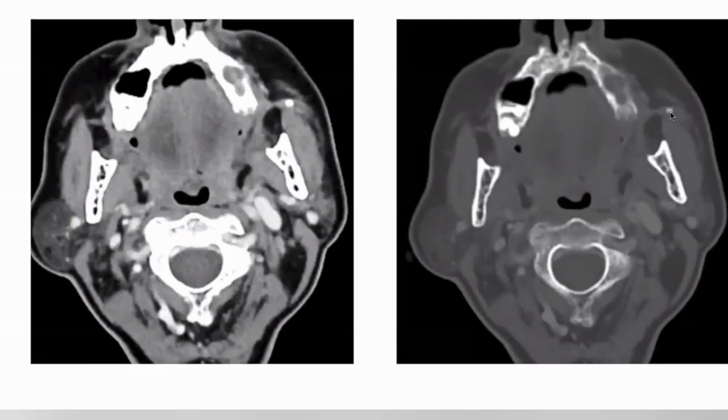This is calcific density within this distal Stenson's duct. Yes, there is proximal dilation of this duct, and then there is atrophy of the left parotid gland. So this has been going on for a while for this patient. That's why the patient had recurrent episodes of parotitis, and later developed chronic inflammation and chronic atrophy. Yes, sir. So this is a case of sialolithiasis.